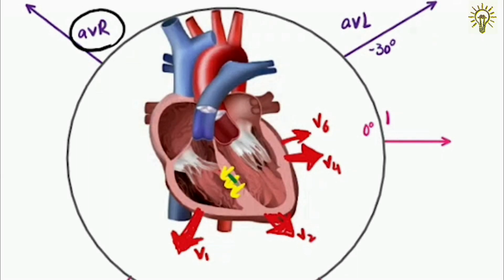Next, the depolarization wave spreads downwards through the septum and distributes to the left and right. Since the left ventricle has many times more mass than the right ventricle, the principal current dominating on ECG is of the left ventricle, unless there is right ventricular hypertrophy. Therefore, the main depolarization wave registered by ECG leads in ventricles is large in amplitude and travels downwards and leftwards.